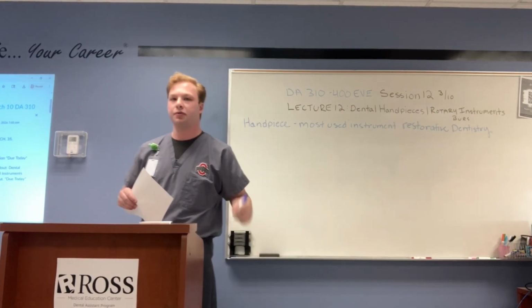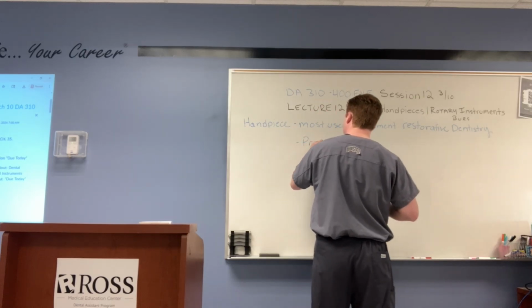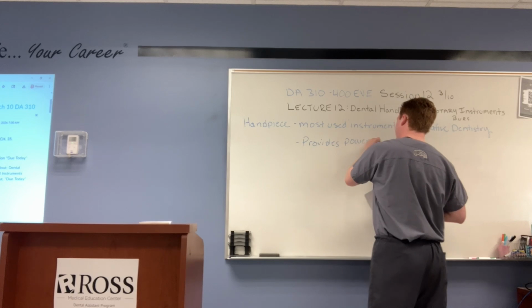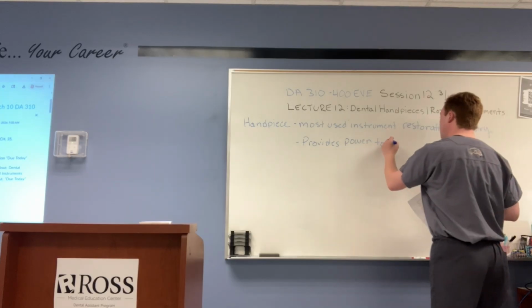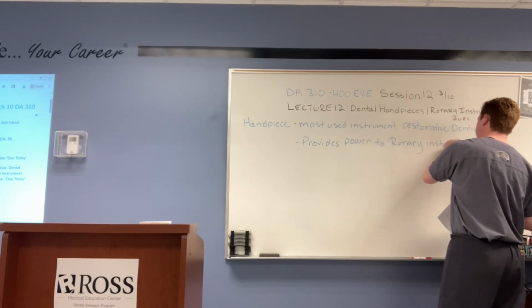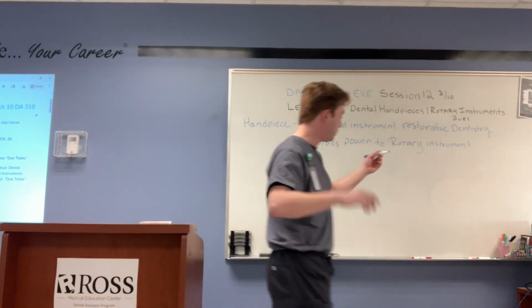So the handpiece provides the motion for the rotary instrument or the burr. So the handpiece provides the power for the burr. But we want to be more specific and say the rotary instrument. So it provides power to the rotary instrument.